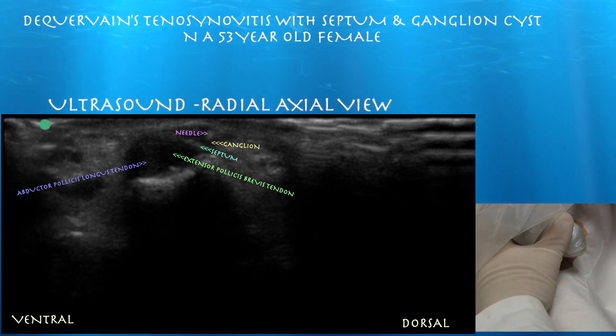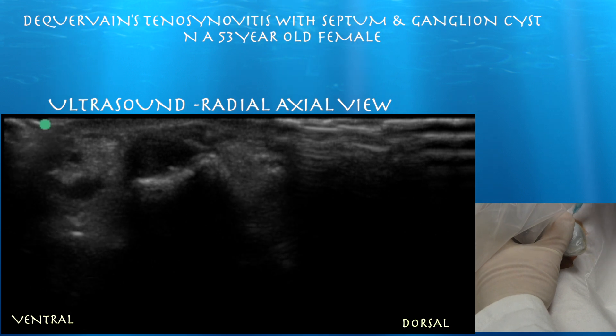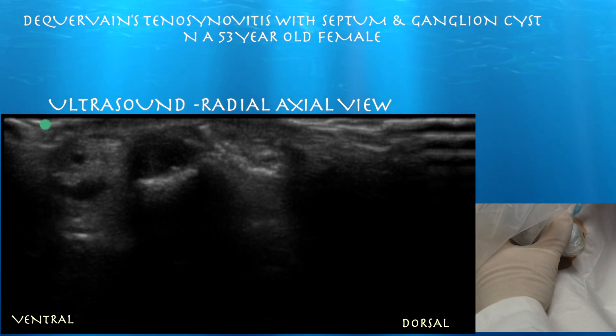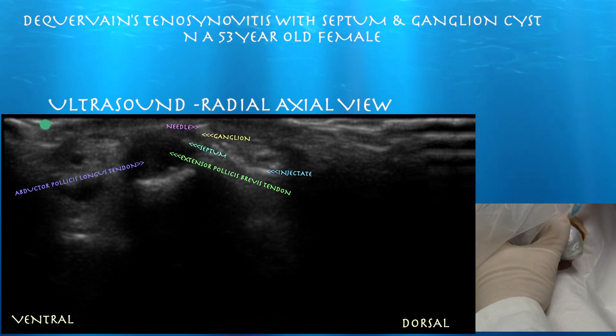Here we are starting the procedure — sticking the needle into the ganglion itself, essentially just trying to break it up with the needle. We're in short axis to the needle, and you can see the needle right in the middle of the ganglion. It's too small to really drain it. Here we are injecting cortisone — you can see it traveling deep. However, I don't think it really entered the first extensor compartment, so we decided to do another injection.